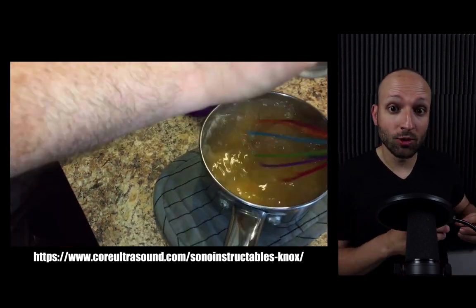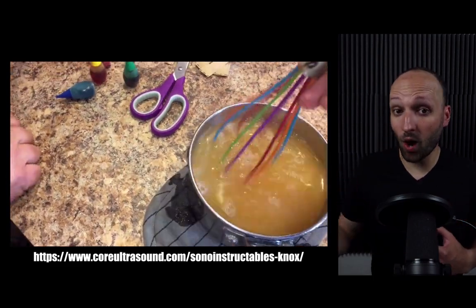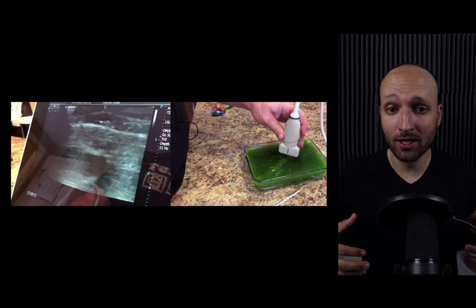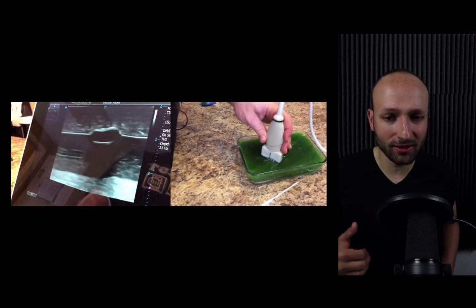There's a section within 5 Minute Sono that is called Sono Instructables, and we walk you through exactly how to create these. You can do this with Knox gel. You buy it at the supermarket. You can create it with just pots and pans at your house. And you can see here that it looks pretty good.